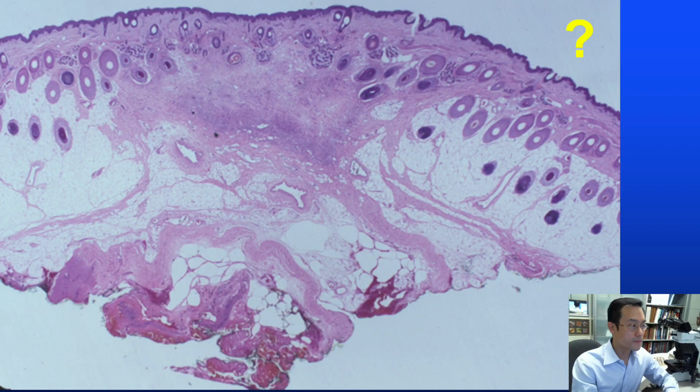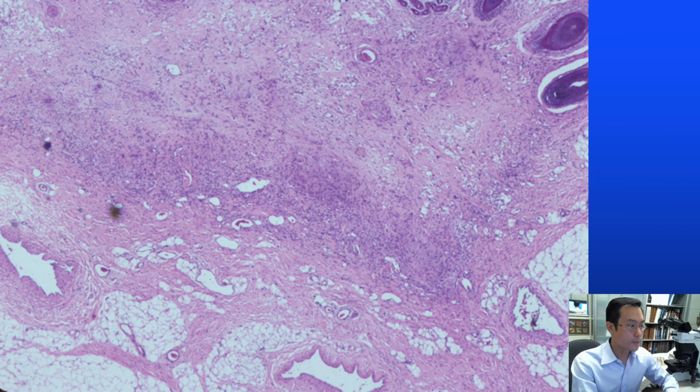So here we go. Am I starting in order of the classification, or am I starting with most common tumors first? Experienced observers may wish to pause and diagnose. If you like a clinical history, this is a congenital plaque of alopecia on the occipital or parietal scalp.